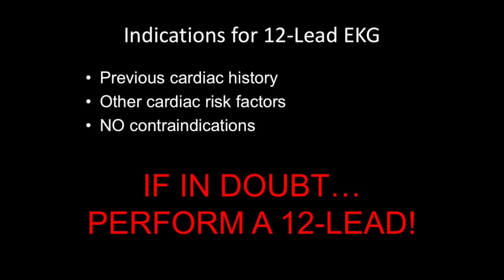There are really no contraindications to perform a 12 lead. It doesn't do anything to the patient. The only thing that a 12 lead does that you could construe into negative is the time that it takes to perform it. But when we did it earlier with the group of people that hadn't done it before, we were looking at 3 to 5 minutes, including the transmission of the 12 lead.